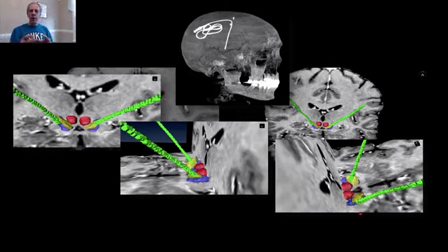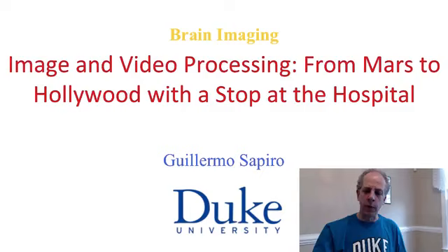So a lot of image processing: we do registration from the different modalities, we do segmentation, and that helps the neurosurgeon localize himself or herself inside the brain of the subject to better do the surgery, of course doing it safer as well, and in the same fashion, after surgery to do a better programming and understand what the actual outcome of the surgery was.